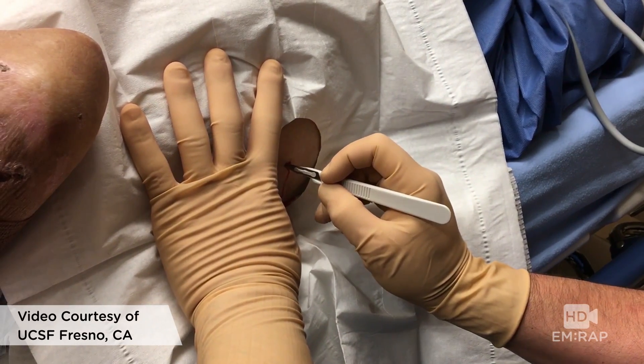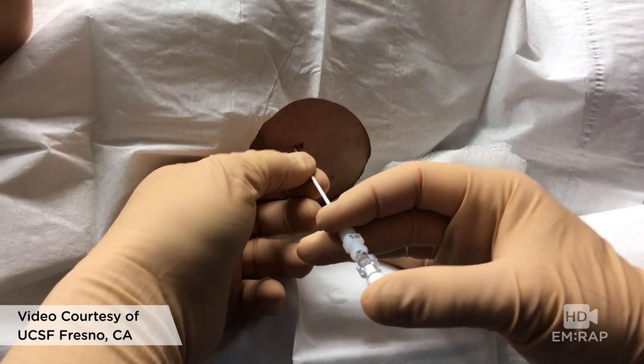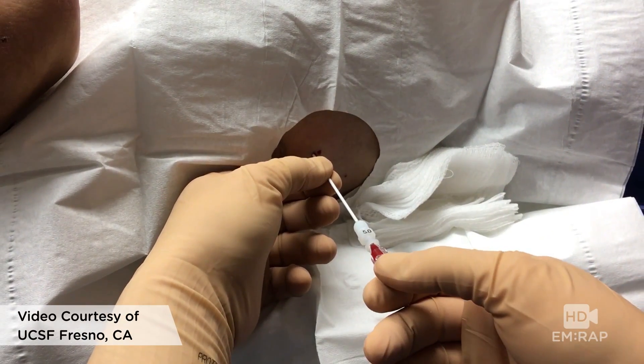Make a small stab incision just large enough for the catheter. We're using a needle with plastic catheter, but it's the same technique as a needle with syringe. Here we nick a little blood vessel — it's common, no big deal.